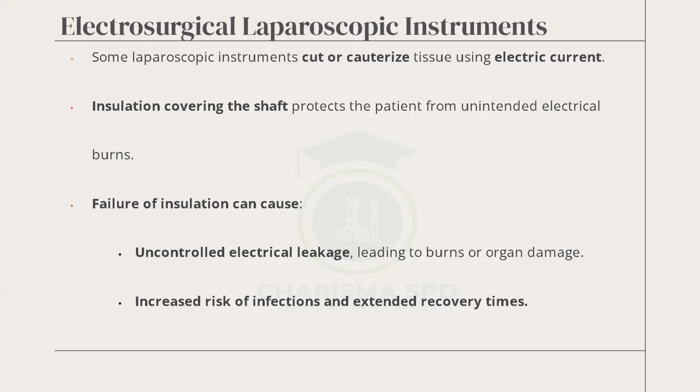All right. And when they are using this laparoscopic instrument, you pass by, you smell that human skin is burning. Increased risk of infection and extended recovery time. Self-explanatory. So when the insulation is broken, you're going to cause a burn, and that means that the patient will need more time to recover. All right, next slide.